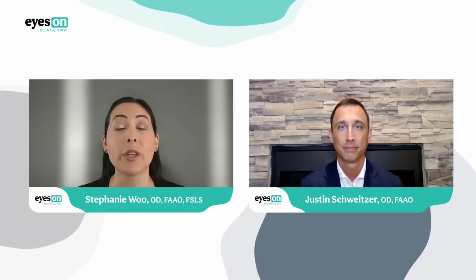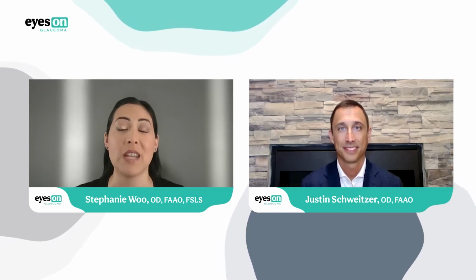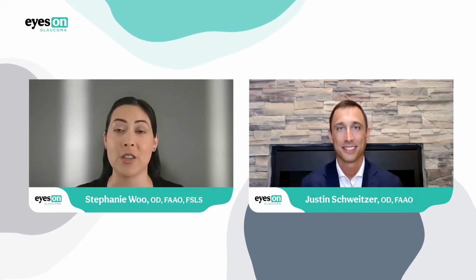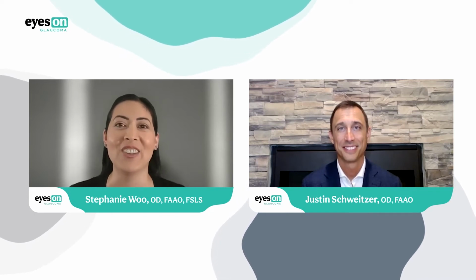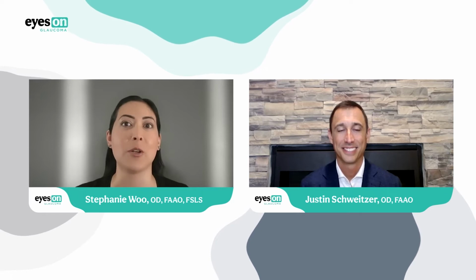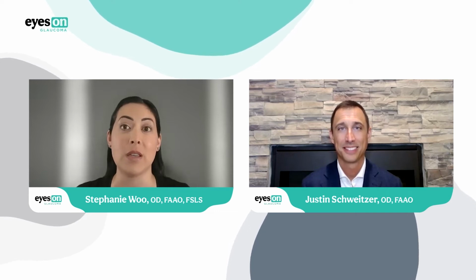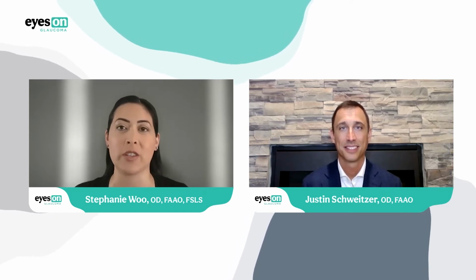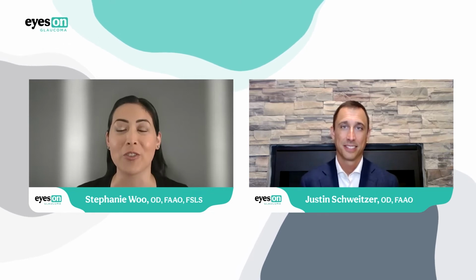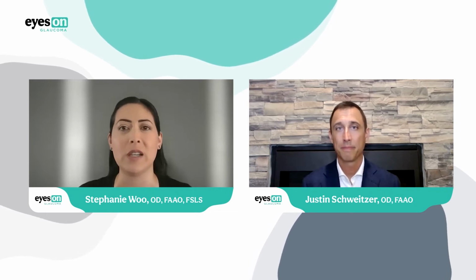Well, I'm really glad you brought up the timing component, because I know for me, that is always so frustrating for the staff. They're like, oh my gosh, first of all, I have to take the patient from the waiting room all the way into the special testing room, which is, why do we put it at the back of the clinic? I don't know, but a lot of us do. And so the patient's going all the way back there. Plus you have to close the door, turn off the lights, make sure all the settings are correct, like you said. Then the technician is going to be in there for however long, and if the results aren't reliable, they have to repeat the test. And then the patient's wiped out by the time their visual field is done. So I'm really glad that you brought up the timing component, because that probably improves efficiency tremendously within the office.